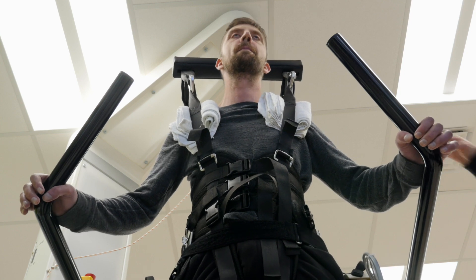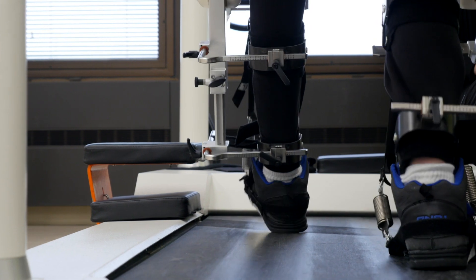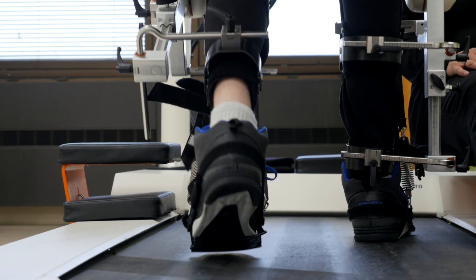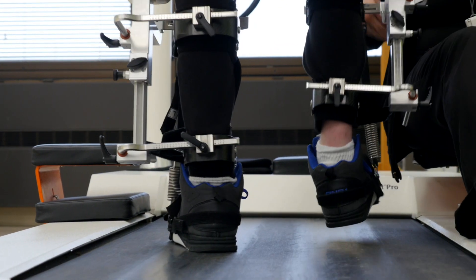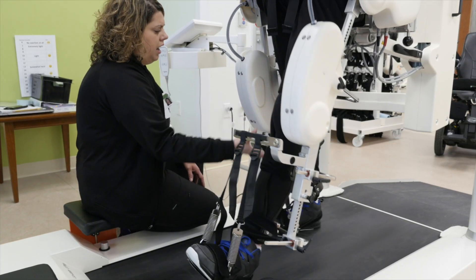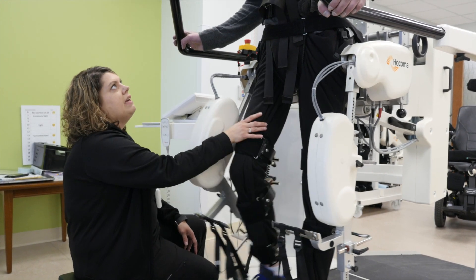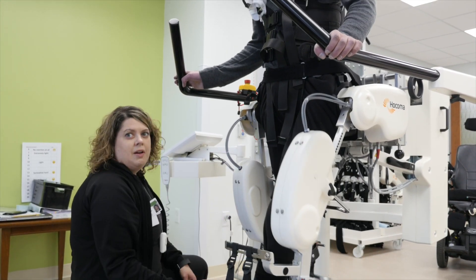Currently the body weight support is suspending about 110 pounds of Derek's body weight, and he's supporting 65 pounds himself. That allows him to work on activating his muscles for standing even though they're super weak right now — he can start to initiate what a normal gait pattern would look like and what it would be like to fire his quads and glutes in standing. Typically we'd start on the Locomat with a lot more assistance, and then as he gets stronger I would transition him to the Zero G.